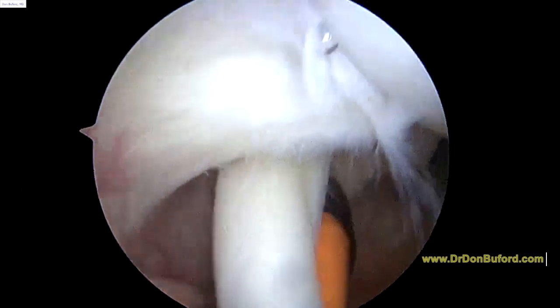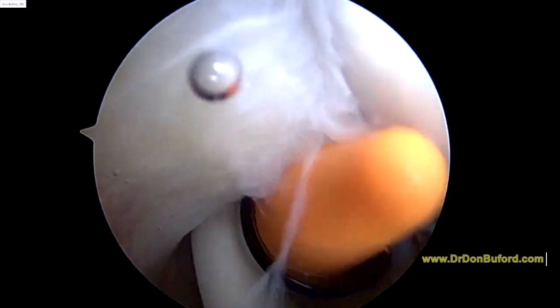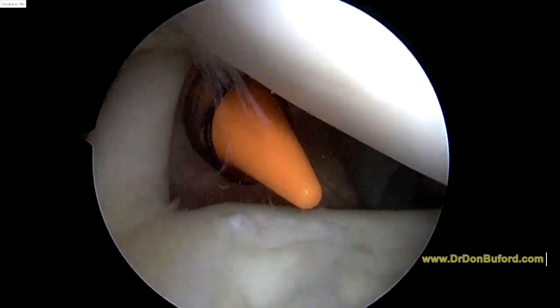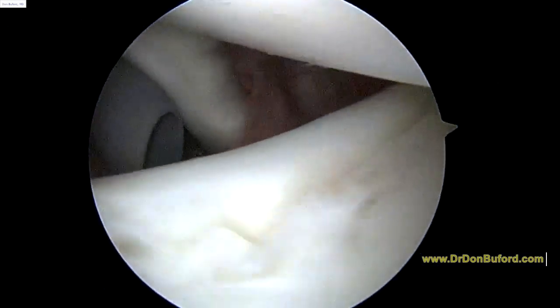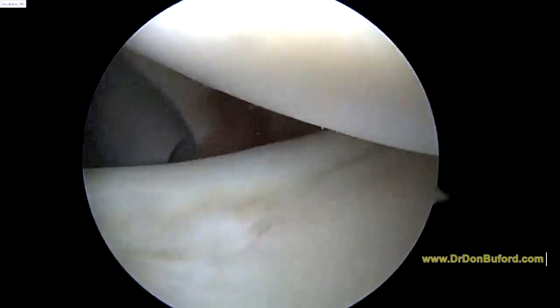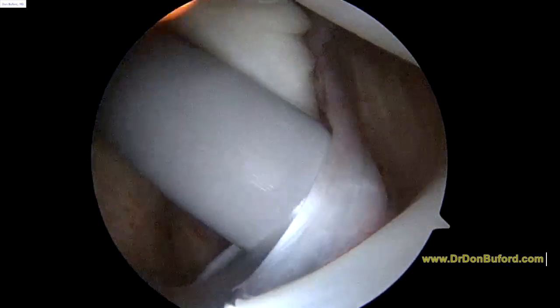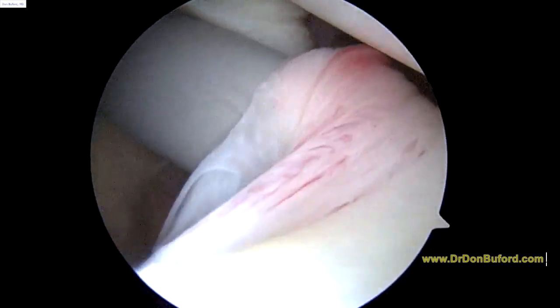Now, as you look at the top of the screen, you've got a little bit of fraying in the undersurface of the rotator cuff, but it's not bad. I don't think that's going to need a separate repair at this point. We're going to look down the front of the shoulder, and we can see the anterior labrum here actually looks pretty good. Okay, the middle glenohumeral ligament's down here crossing the subscapularis tendon. That's part of the MGL.